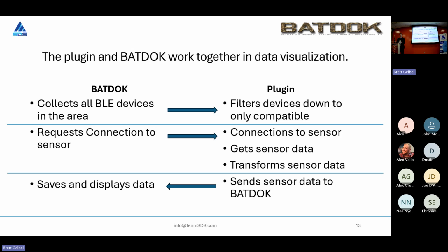It can then use its sensors to connect to several different patients and analyze them. I'm sure BATDOK has the capability that you could have one sensor and list your own vitals on it, so it could work in both scenarios, I would imagine, but I think it's more designed for the medical personnel.